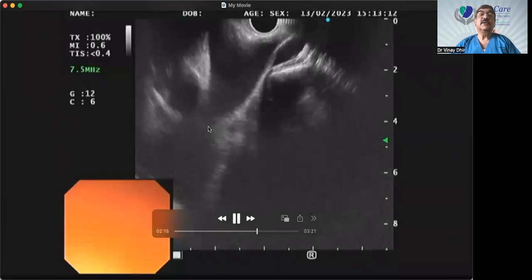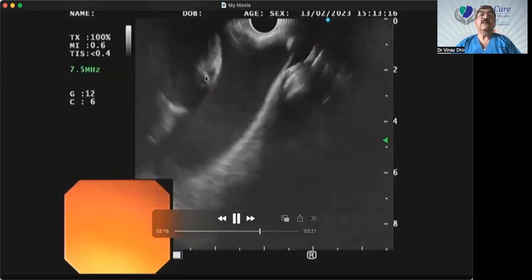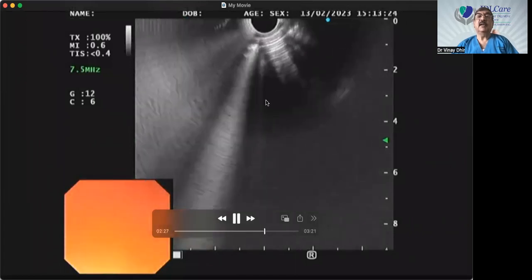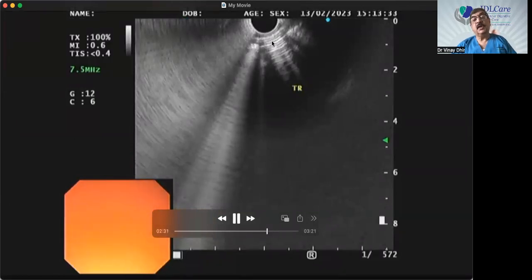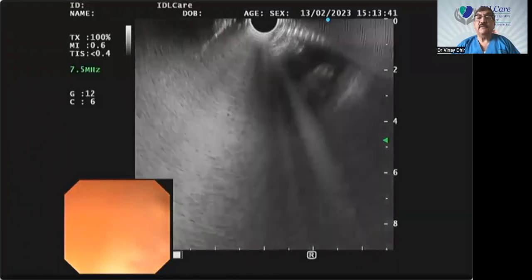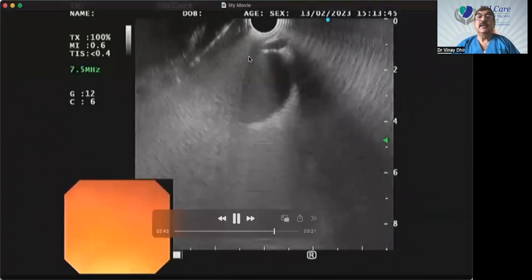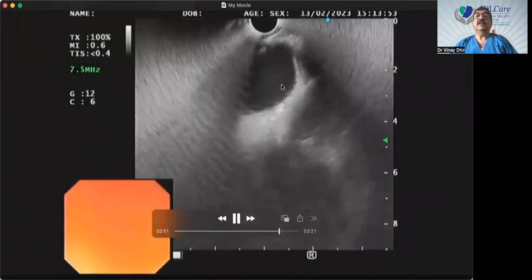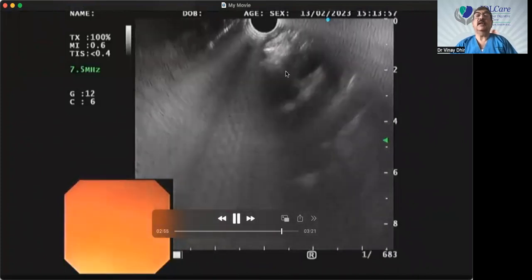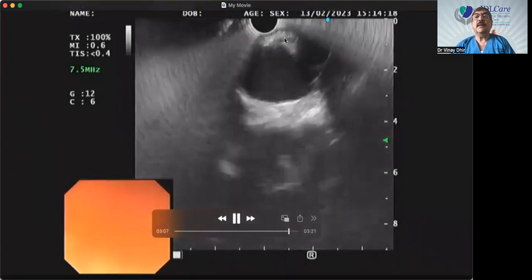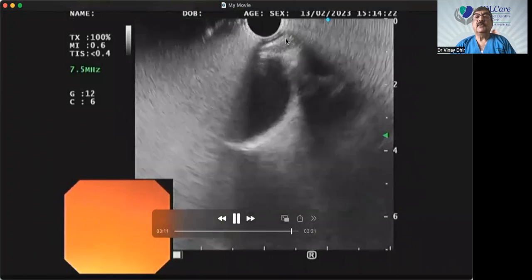This is the arch. This is the pulmonary artery. Station 4 is here, station 5 is close where it actually crosses, and then station 6. Going a little bit further inside, we are now seeing the trachea anteriorly. Turn a little more clockwise and push down to see station 7 — the subcarinal. The classic landmarks are the left atrium and the pulmonary artery. You will see two large round things: pulmonary artery and left atrium. This is station 7. Here you are seeing some lymph node which probably is reactive.